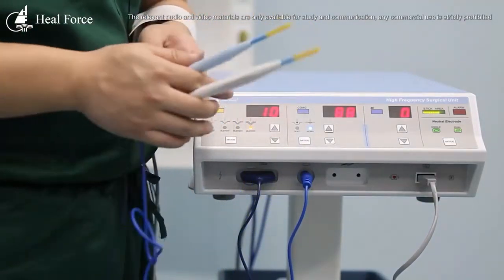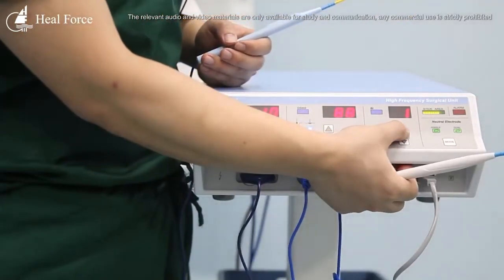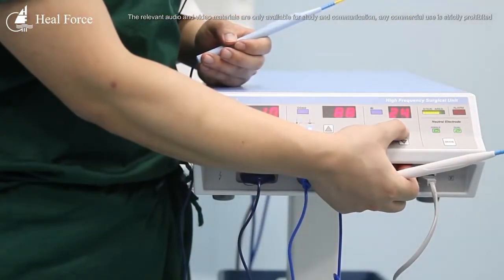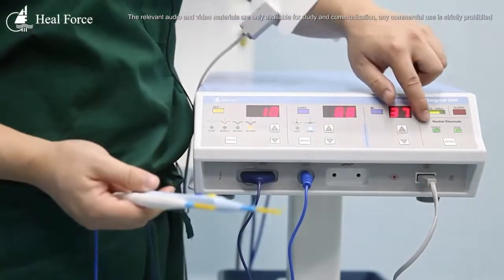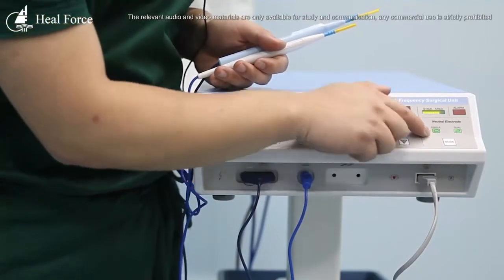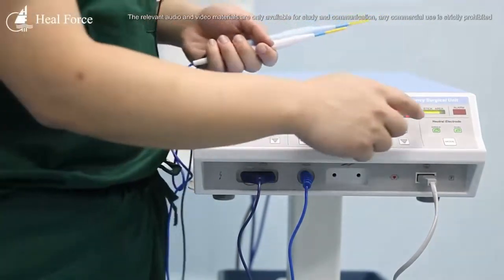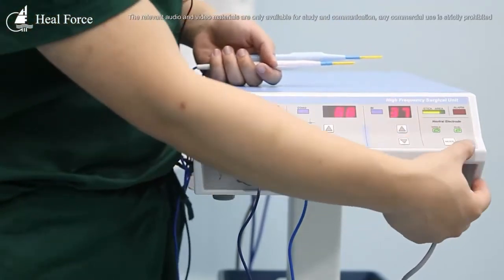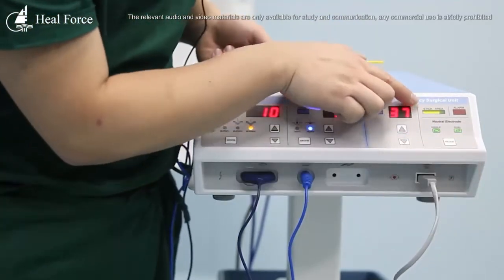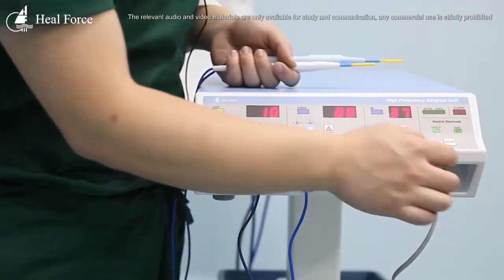For bipolar, we have a pencil controlled by a foot control, and you adjust the output accordingly. Regarding electrode plates, there are two types: single and dual. We are currently using the dual plate. Only when using dual plates can you see the stick area reading. If you are using a single plate, the stick area cannot be displayed.